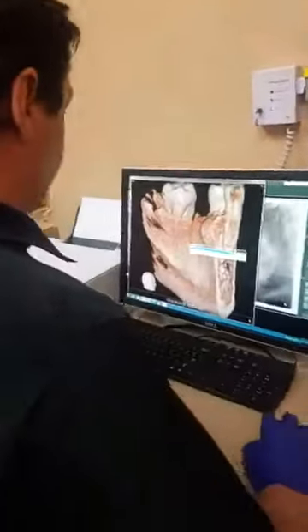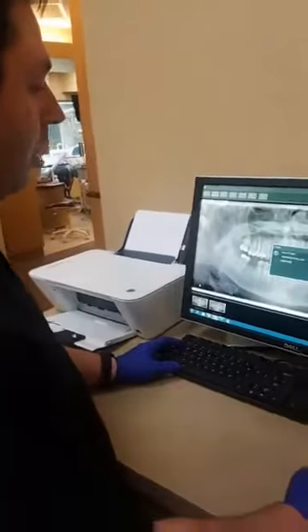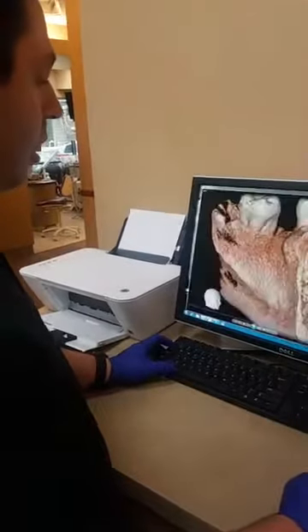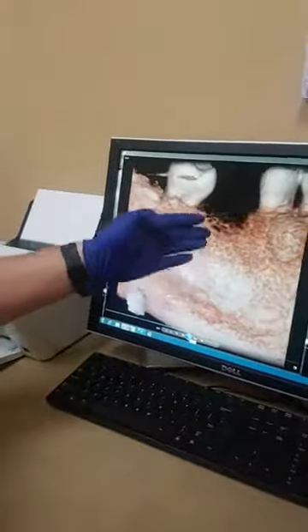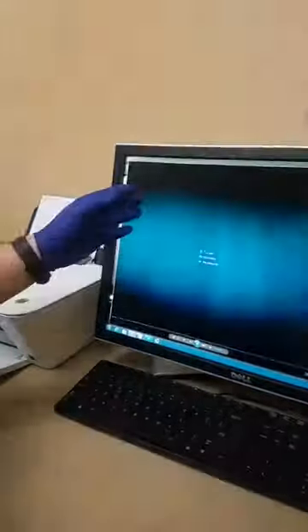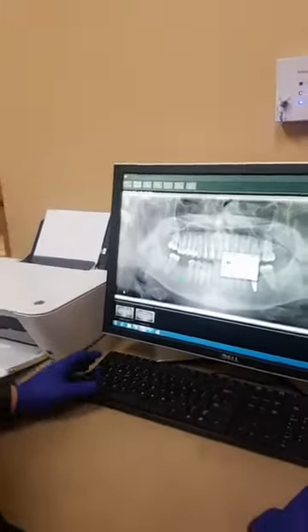It actually formulated around in a circle with a two-dimensional image, making this three-dimensional object more stable. It took this particular movie as it went around David's head so that we can see the specific bone that we need, the nerve that David has in his mouth, and also the appropriate anatomy, so that we can not only size and image the implant that we're going to place in his mouth, but make sure that it's stable and something that's really long-lasting.